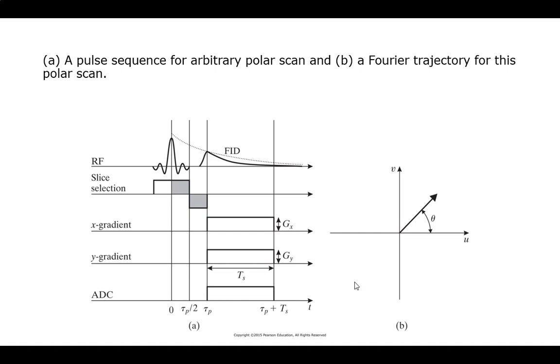you can measure that angle basically by the ATAN of those two. So I just set X and Y, and I leave them both uniform for the reading. By doing that, I am now walking along that axis. Therefore, the conversion into Fourier or K-space domain is going to be along the same angle. Remember what we did with X-rays? This is basically the Radon transform.